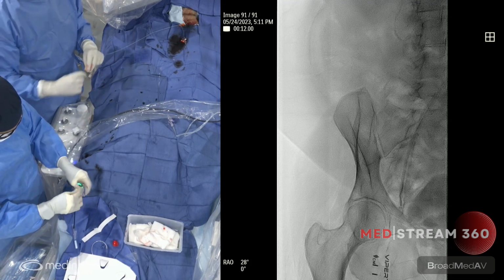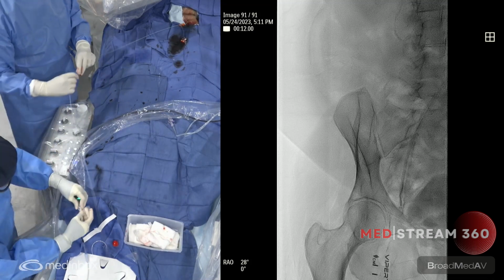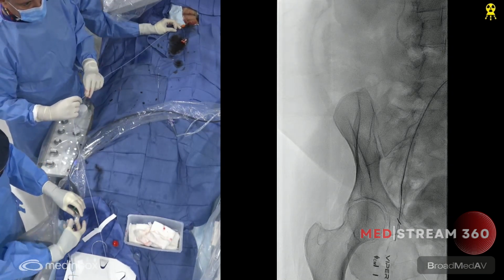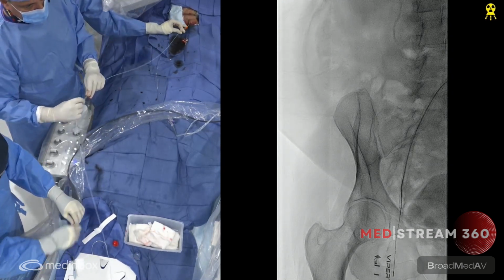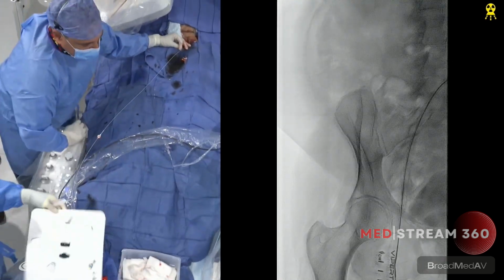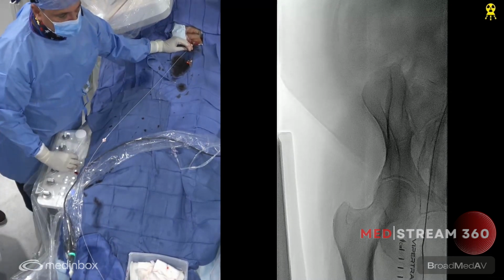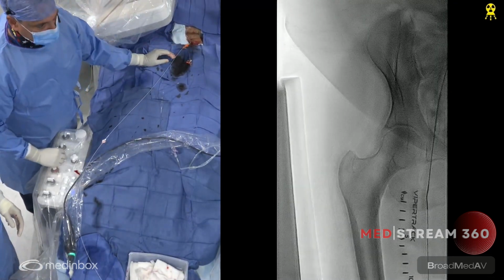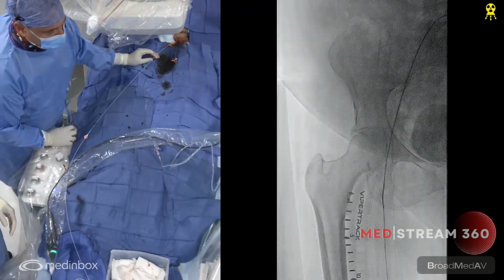The idea that we're going to try to do is to cross this intraluminally, which would be ideal. Not that we have any data to support one way or the other, but I think intraluminally will be a reasonable way to support this. You can see here, I got it, brother. We're just going to cross this, get this catheter and this sheath into that area and meet up with that distal occluded segment that we're looking for.